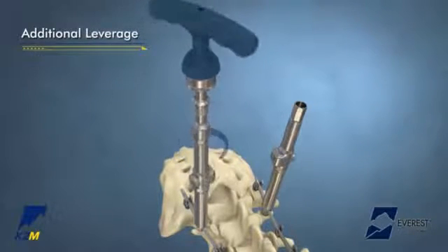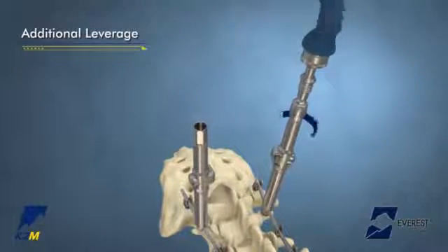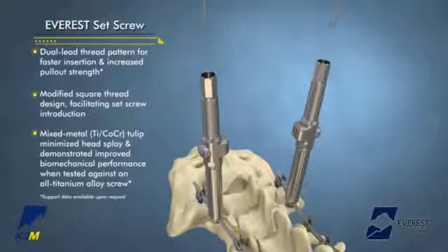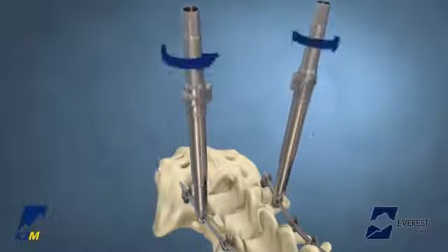Once the Base Camp Tube is in its proper position, turn the proximal handle in a clockwise direction until the desired reduction has been achieved and the rod is fully seated. The Everest Set Screw may be passed through the center of the Base Camp Tube and threaded into the implant housing using the provisional driver to provisionally tighten the construct. To disengage the Base Camp Tube, press the release button and pull upward while twisting to disengage from the implant housing.